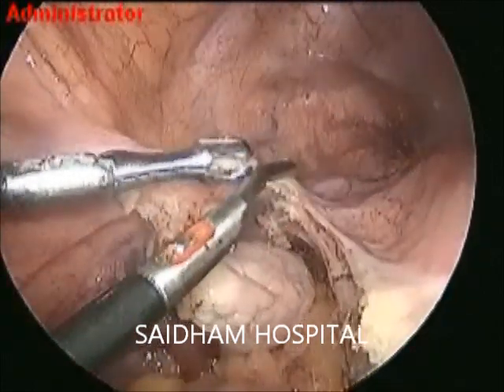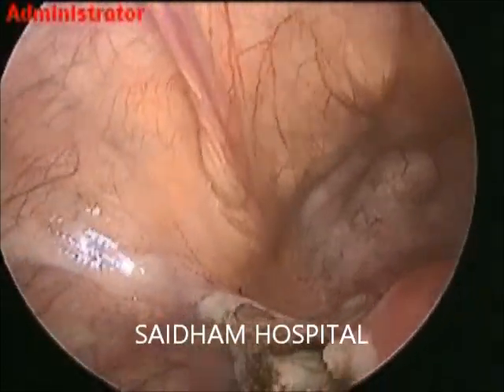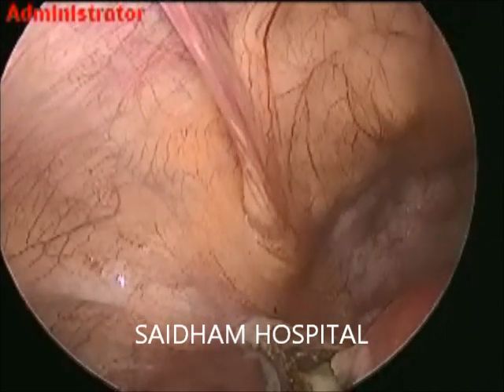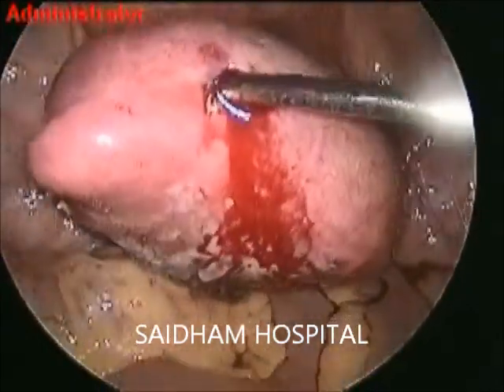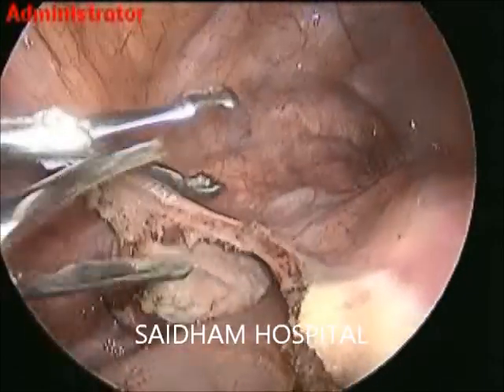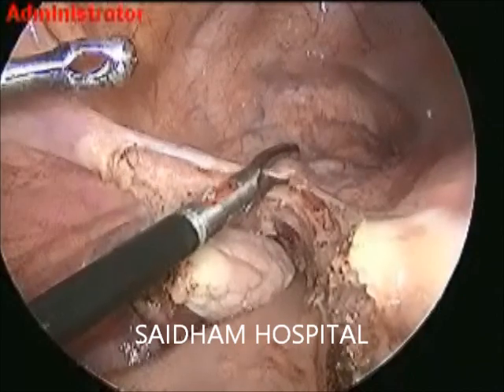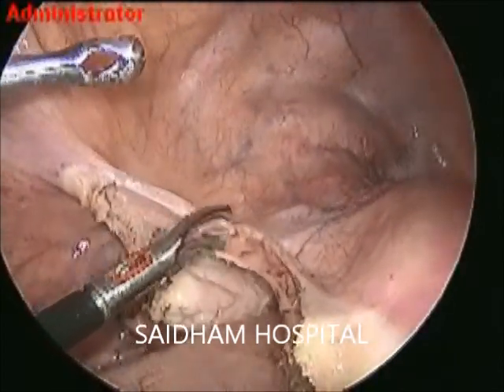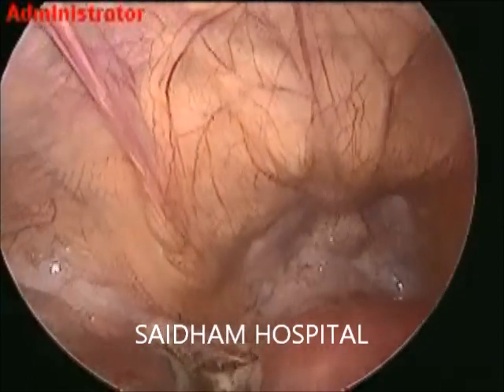We should cut the anterior UV fold just 1.5 to 2 cm below the arcade line, which may differ as per the case. Why should we go posteriorly first in such cases? Because we get the idea of the uterine artery and plane separation — plane identification of the UV fold is easier. Only three structures should be cut with pure cutting mode on the bipolar: the anterior leaf, posterior leaf of the broad ligament, and the UV fold.